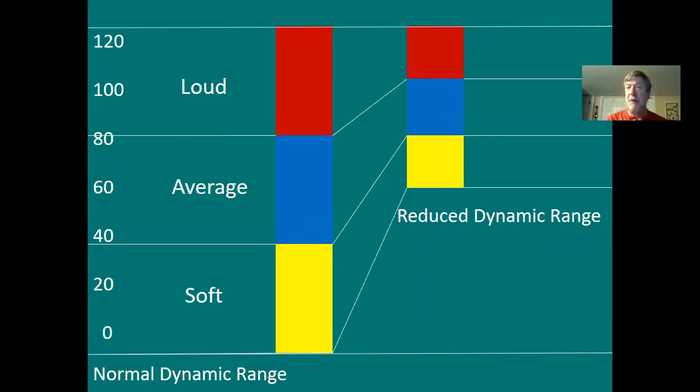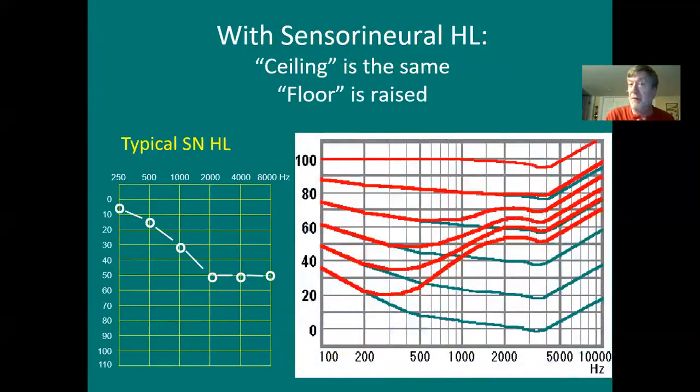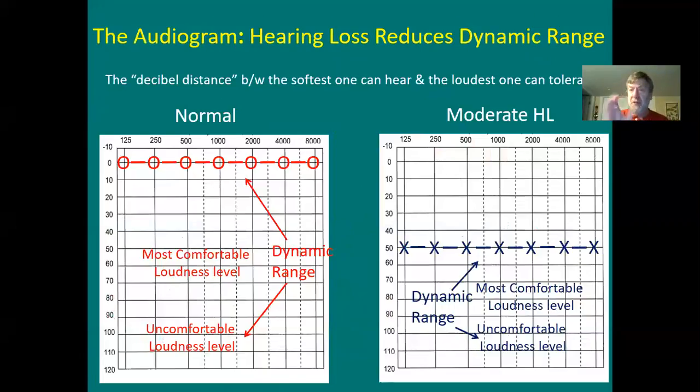The amplification would be simple, but it's not in our case, which, by the way, explains why hearing aids are so expensive. Tell your clients this. What kind of amplifier changes the amount by which it amplifies? So that soft sounds are automatically amplified by a lot, and for loud sounds the hearing aid automatically backs off. That takes quite the technology, okay? Anyway, here's another way. Let's look at reduced dynamic range, because this is the mother lode behind fitting methods. This is where they all come from.